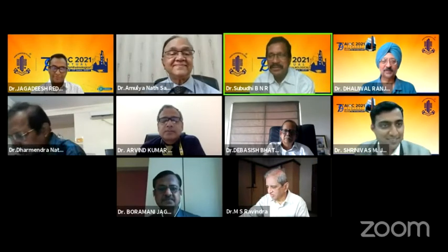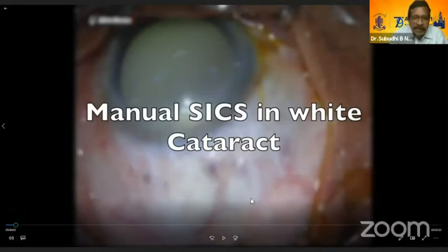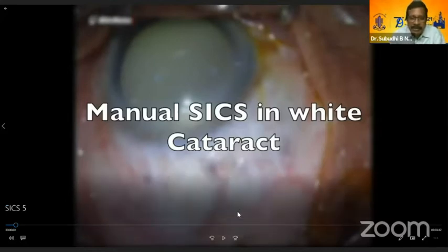Thank you, Srinivas. My topic is manual SICS in white cataracts. In our country and in our parts, white cataracts are very common. We come across these types of cataracts regularly. Whatever I speak is for the beginners only. Beginners must be very careful, because every time they will land in complication in this type of surgery. So I will show everything in the video.